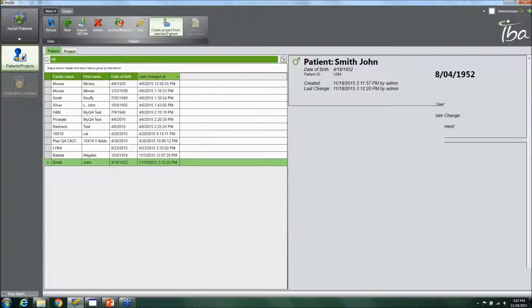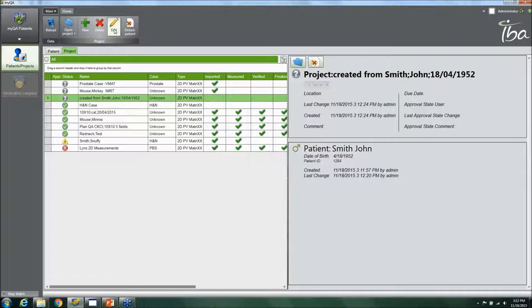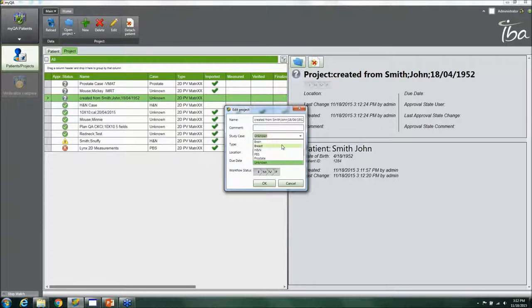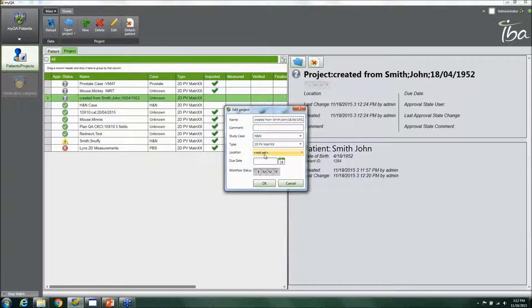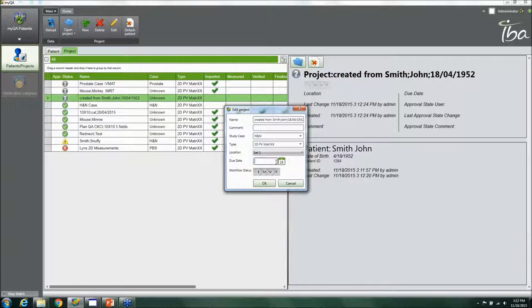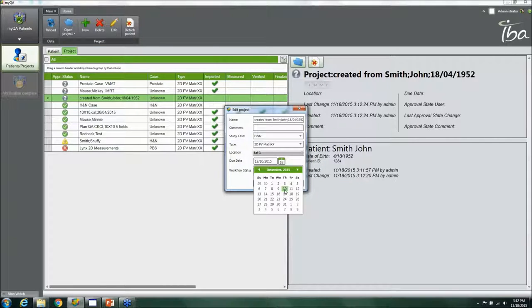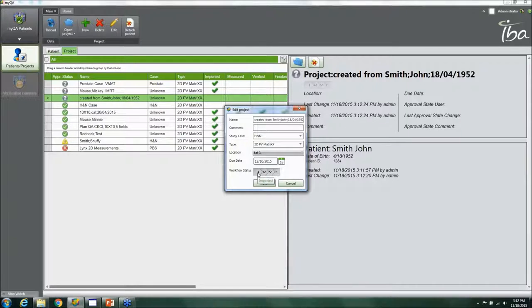Once the patient is created, you can go to Edit and specify what kind of patient it is — for example, head and neck — and what kind of detector you're using, such as a matrix or a matrix flattening filter-free device. You can assign a location, like Satellite 1, give a due date for when the QA needs to be completed, and set the workflow status, which is reflected in several windows of the software to help manage your patient load.